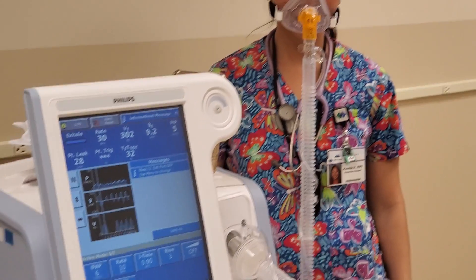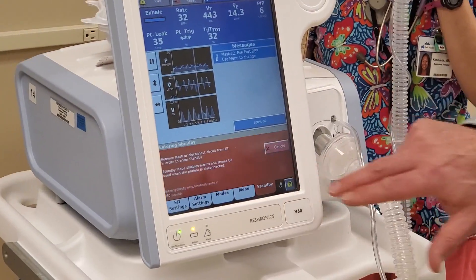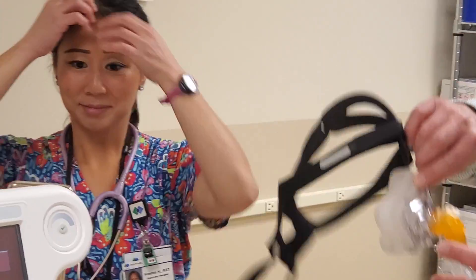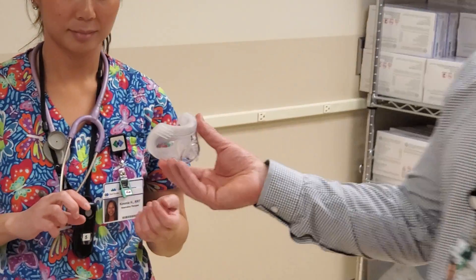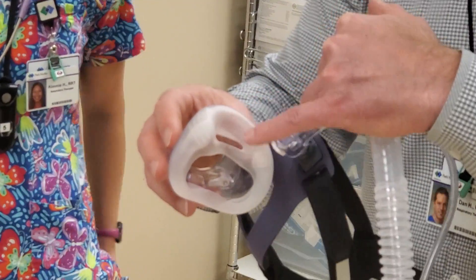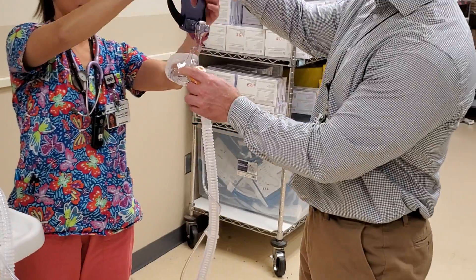We rotate masks every four hours. We'll change the mask out now, so we'll put it in standby mode and take this mask off. Nursing isn't responsible for doing this, but you should be aware of the other mask because this one fits underneath the nose — nothing is on top of the nose, just underneath. You can see there's a little piece that goes under the nose so the nose sits on top of it all. We'll put this in and try that on.